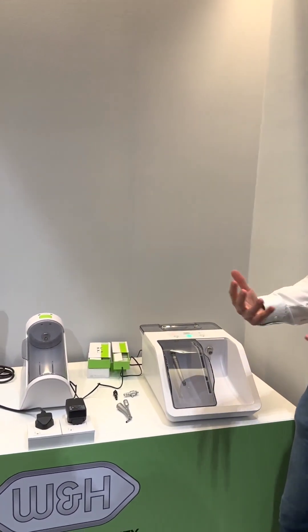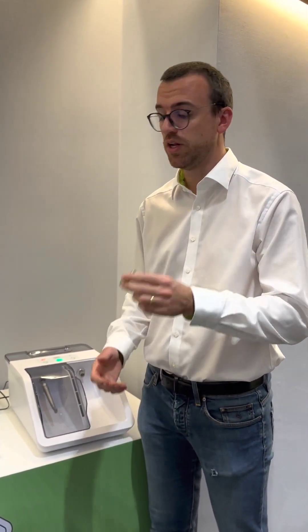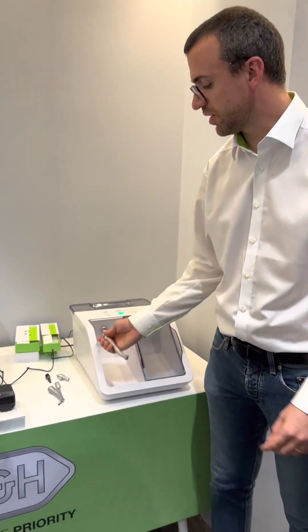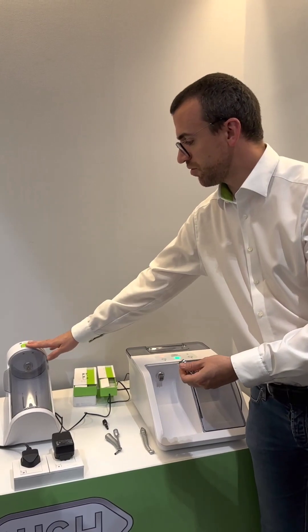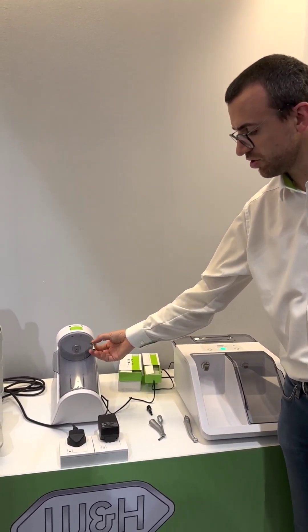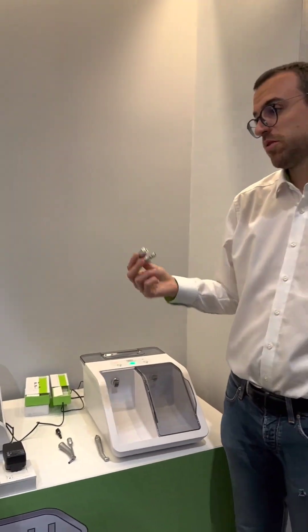Not much explanation needed for the customer — they just have to select the right adapter for the first time. This is the standard one for the electrical. Pay attention on the turbine to select the right one in terms of configuration. This device has three different configurations: one with just the ISO connection, one with the RM, and one with both connections.